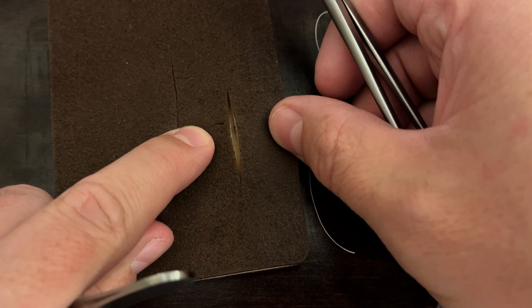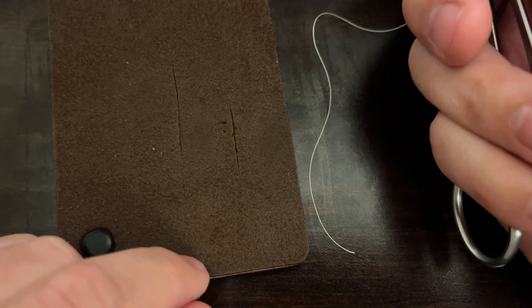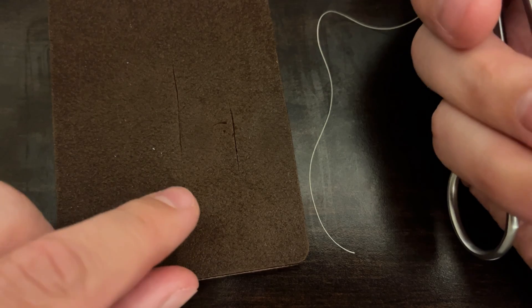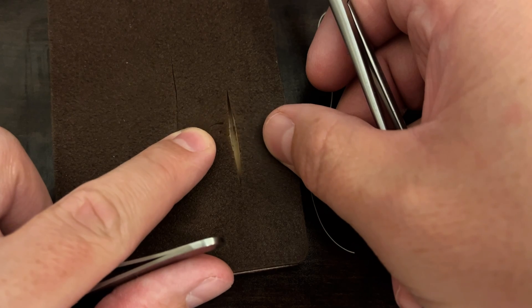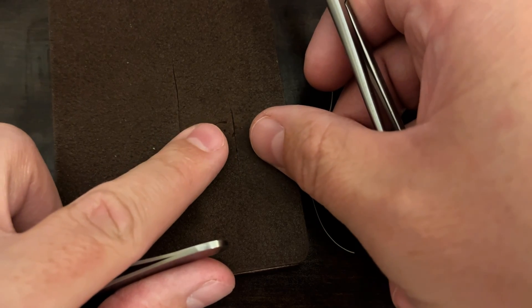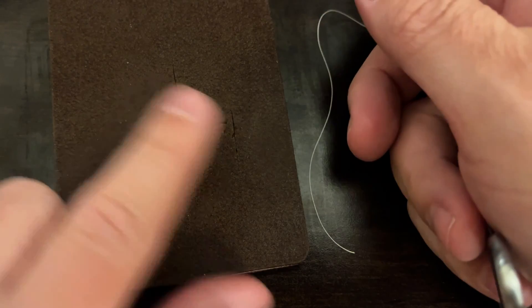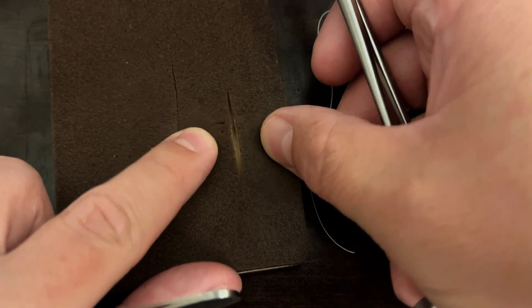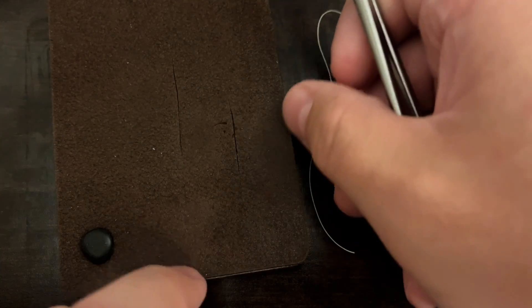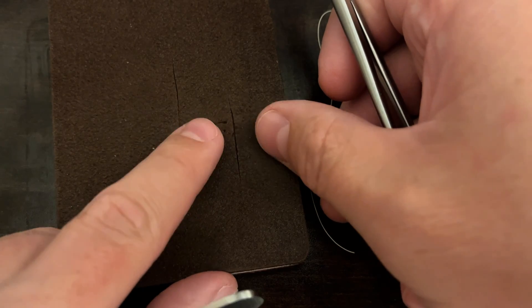We don't use subcuticular suturing in areas that have a lot of tension, pressure, or a lot of movement. So you wouldn't want to do this technique over things like the elbow, the wrist, anywhere in the hand, the knees, or the foot. This is meant for areas where there's not a lot of tension and you're trying to minimize scarring, because your suturing is all going to be buried with dissolvable suture and steri-strips over the top to reinforce it when you're done.